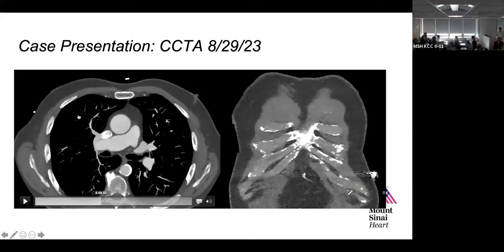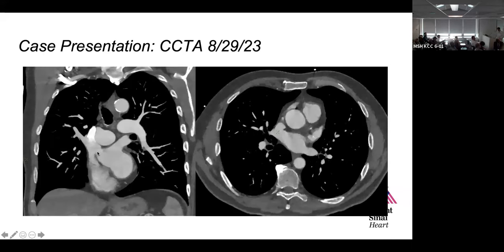And one thing that's also important in CT to know is you're injecting and imaging at a certain time that we have prescribed. So it is quite possible that, for example, you might not see the innominate vein, or you might not see the IVC, or you might not see the azygos vein. So it's also important to compare your CT to your MRI, where those things might have been seen on a cine or in an MRI.